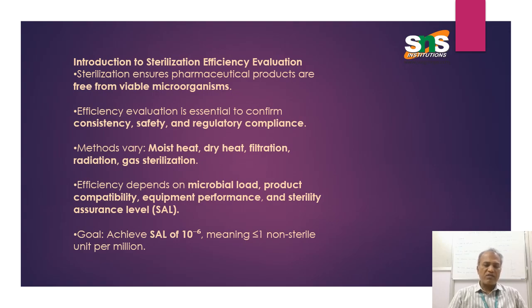Next, methods. What are the methods to be evaluated? Moist heat, dry heat, filtration, radiation, gas sterilization. These are the methods performed for sterilization. These methods have to be properly evaluated and documented for their efficiency. Next, efficiency depends on the microbial load or microbial accumulation. Next, product compatibility.